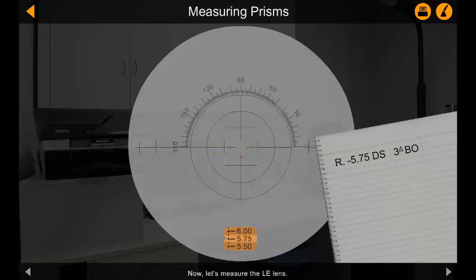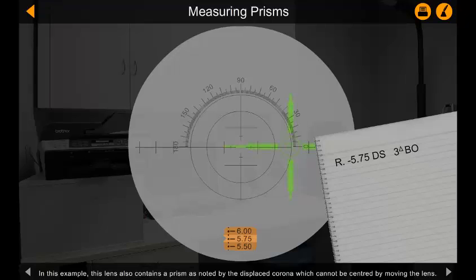Now let's measure the left eye lens. In this example, this lens also contains a prism, as noted by the displaced corona, which cannot be centered by moving the lens.